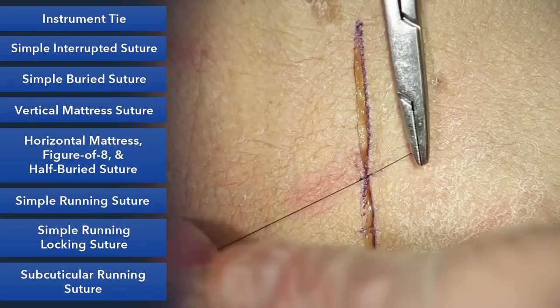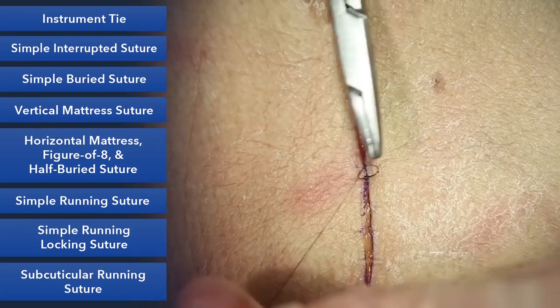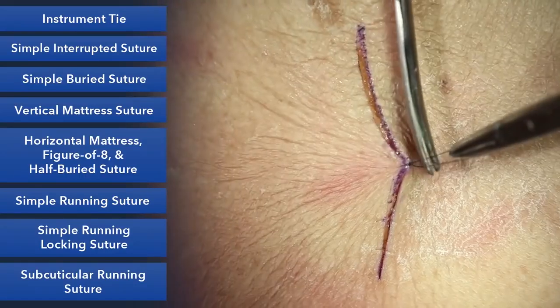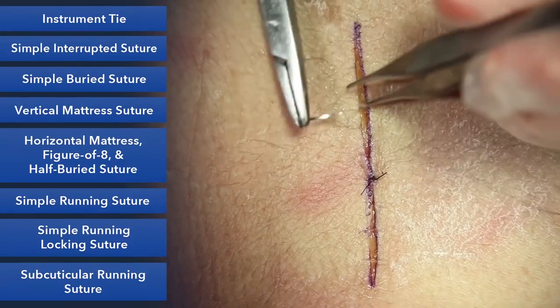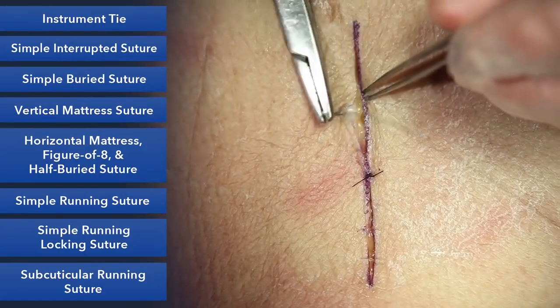Here we'll set up an instrument tie. We do three throws for nylon and go ahead and clip this. This is approximation without tension. You want to go back a couple millimeters for each bite — if you go back too far it'll tend to invert the skin, and we want to avoid that.